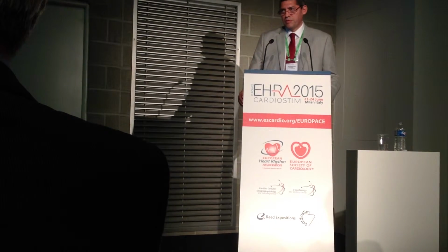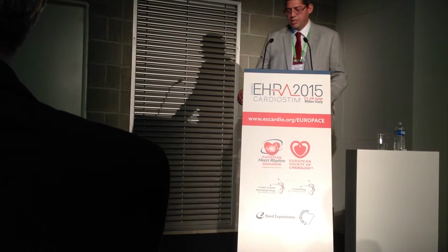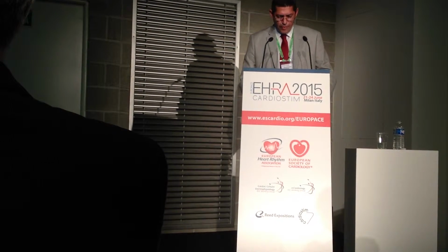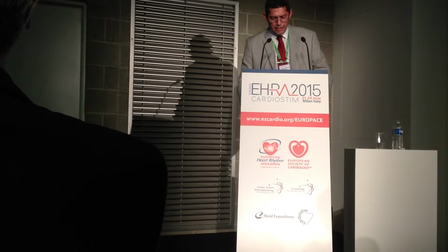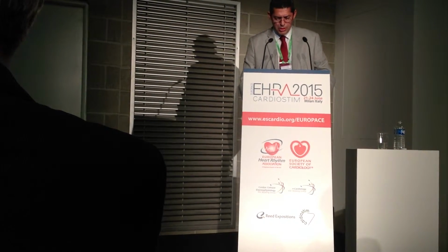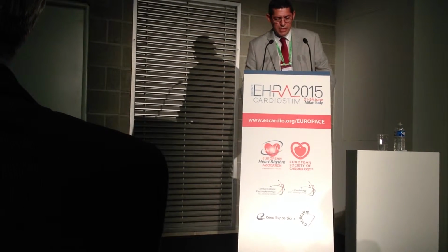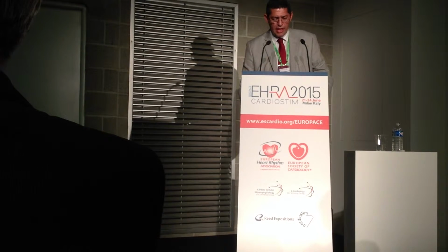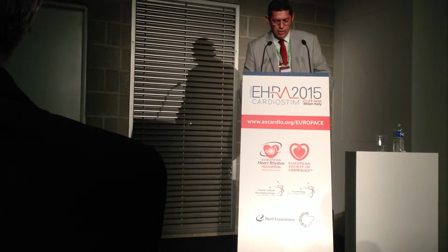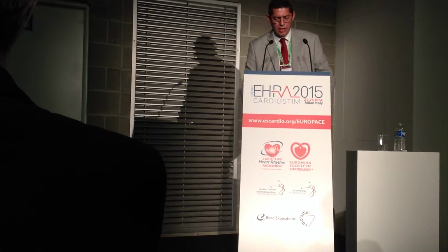Now let me show you data about our first Latin American catheter ablation registry, published in Europace 2 months ago. We included 13 countries, 120 centers, and more than 5,000 procedures, in which 728 PVCs and 280 idiopathic VTs were included. And the success was 86% in idiopathic VT, and 83% in PVCs.